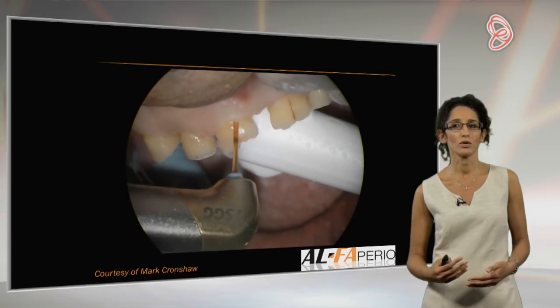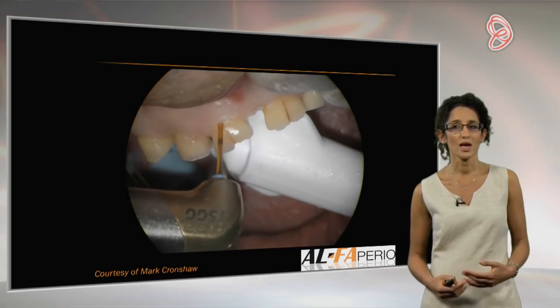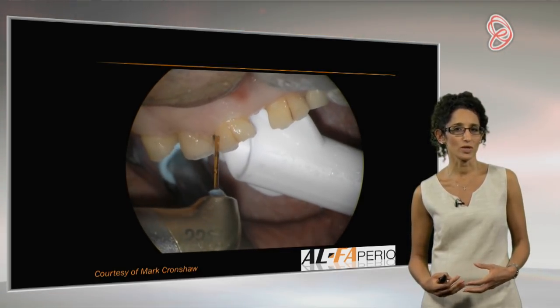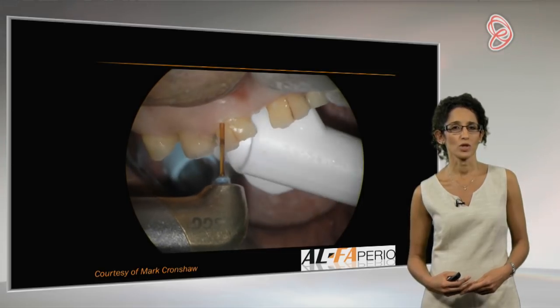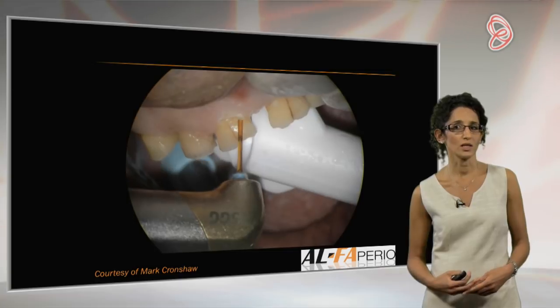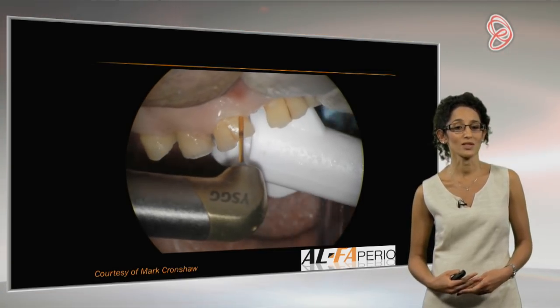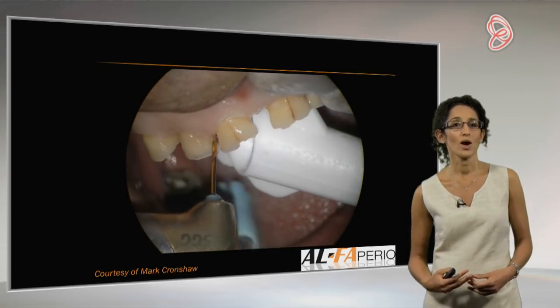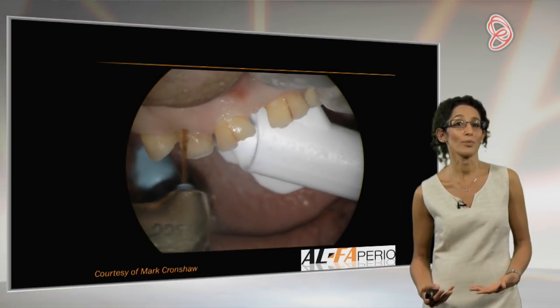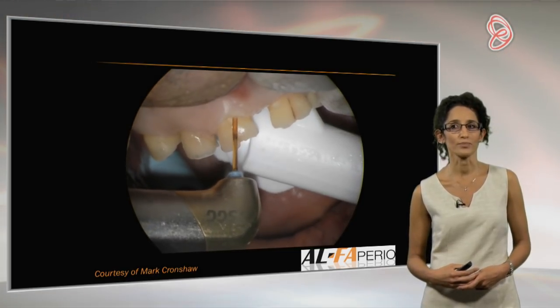He's using a long zirconium tip. It is letting off lots of water, and the laser just tends to make a clicky, popping noise, which the patient obviously hears, and we have the suction going as well. There is a smell, although you can see we're not really burning the tissues. It's just something called the laser plume. That's what happens when the tissues are evaporating, which is how it cuts. It's a term we call ablation.